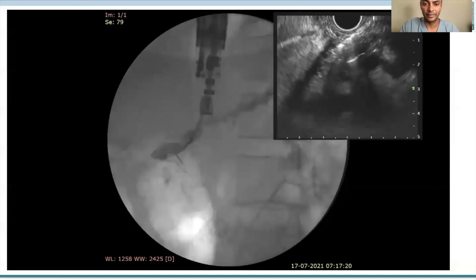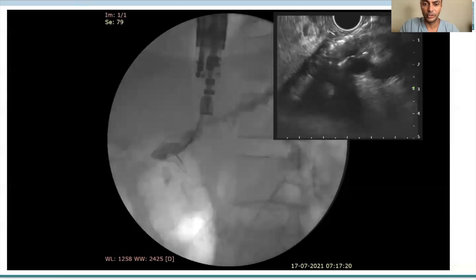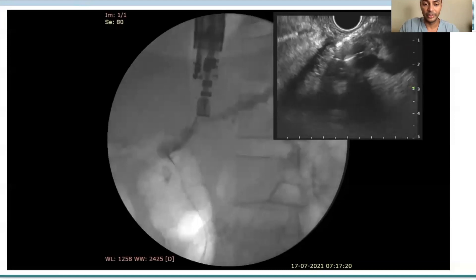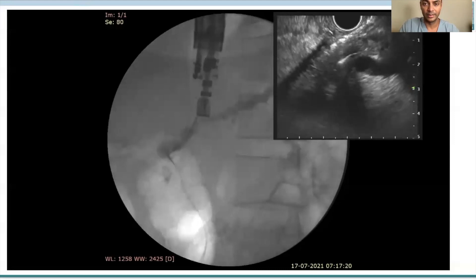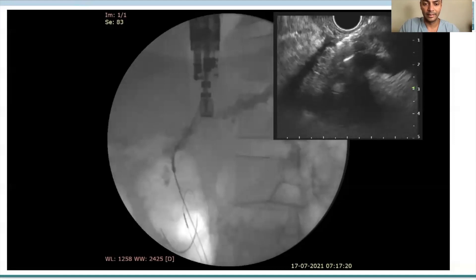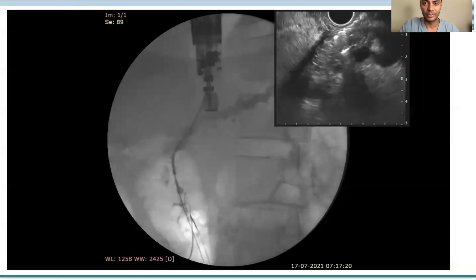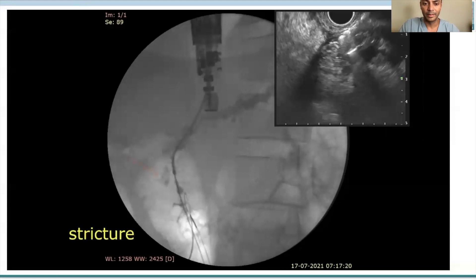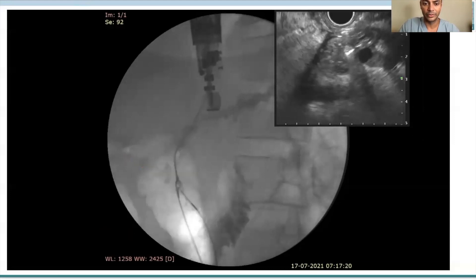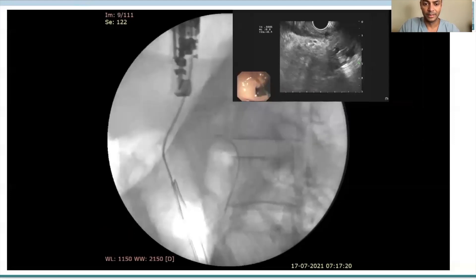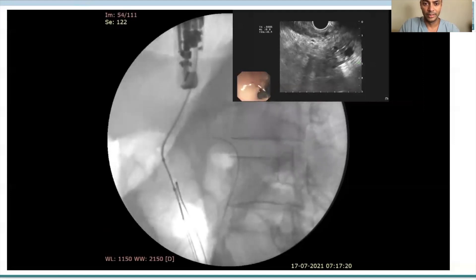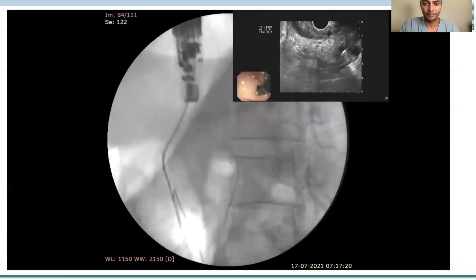We then exchanged the wire for a 0.035-inch guidewire, which was eventually advanced across the papilla into the duodenum. The cystotome was advanced further, but there was a stricture preventing its passage into the duodenum. Therefore, we used a 4-millimeter hurricane balloon to dilate the stricture.